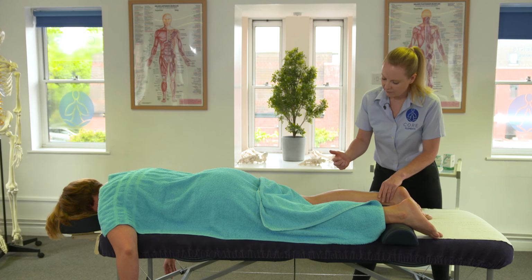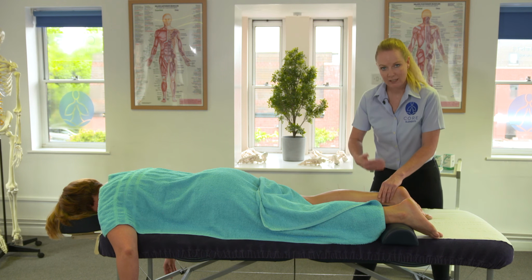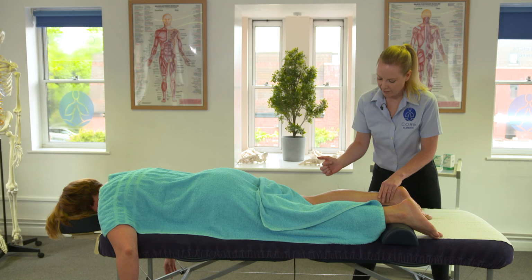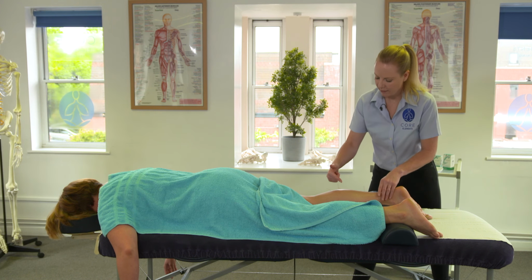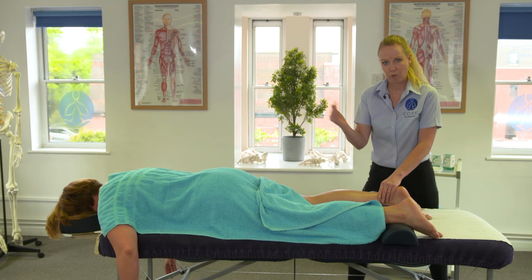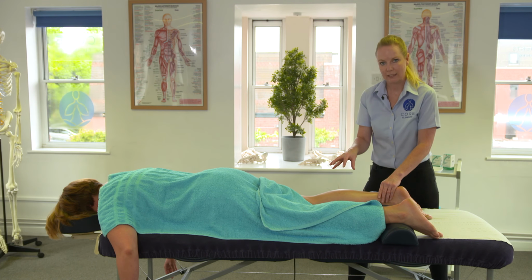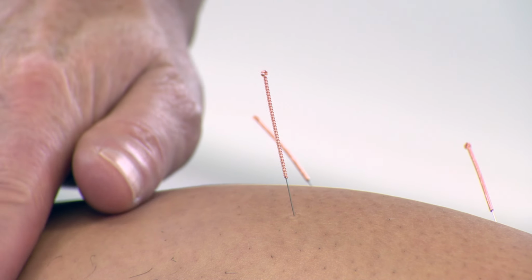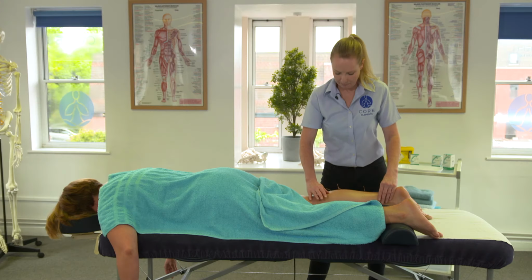Okay, the first activation method that I'm going to use, just so that Katie starts to experience some sensation from the needle, is the flicking method. Literally with the back of the nail, we're going to flick the needle there, and that will send a vibration down the needle into the tissue. So we've flicked all of those. Do you feel anything coming off any of those needles, Katie?